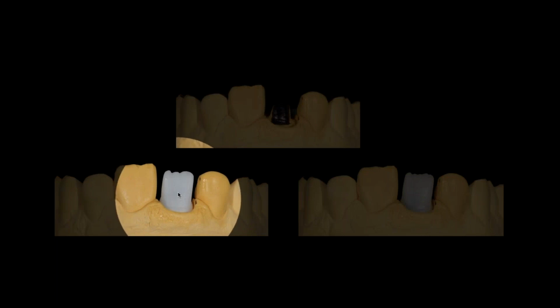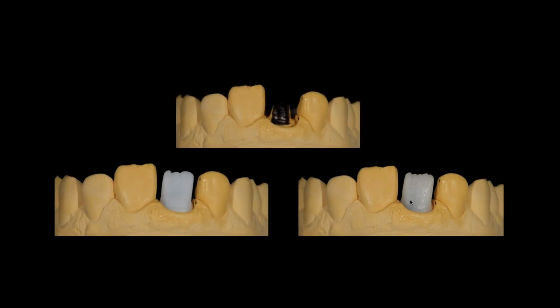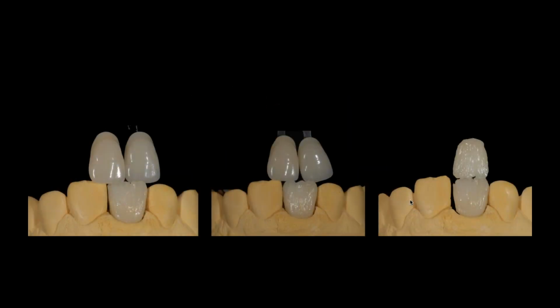So that means I'm dealing with a lower value situation right off the bat. And I'm going to have to really figure out, do I thicken up my material, my coping, or do I really start to use more opacities if I'm going to layer or even micro layer? And yet, if I went translucent, look at how much of that coloration comes through. So probably not the best choice for me.